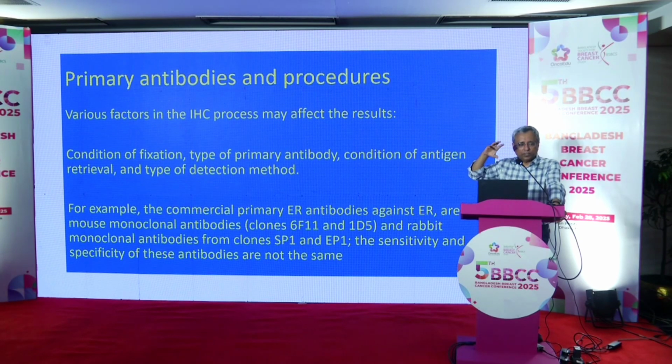So standardization is very important. It's better to use similar clones and very similar protocols. That's not always possible, but if you try hard, as much as reasonably possible, that should be done. But at least try to use clones that are recommended by the regulatory bodies.